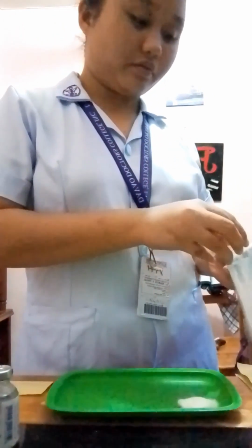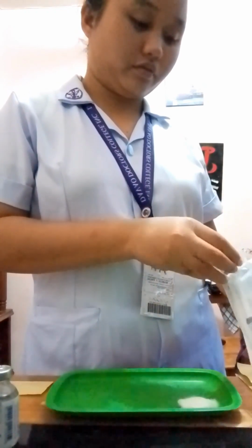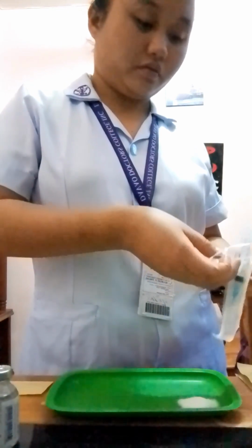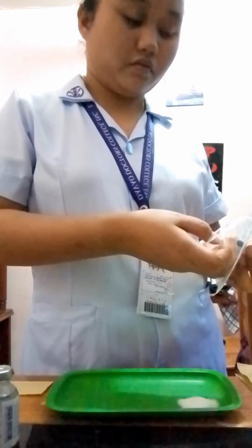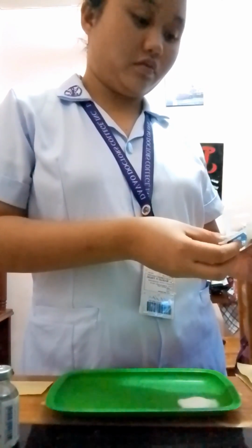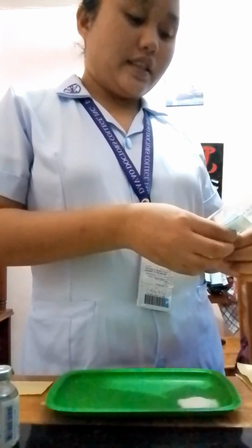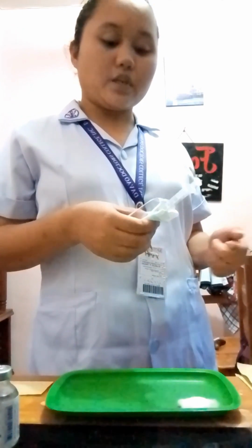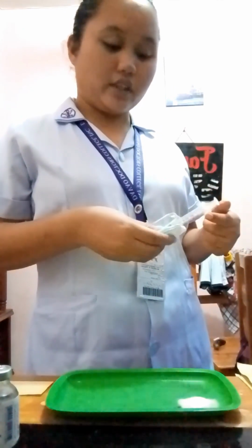Now we just need to open the sterile pack. And since my syringe is readily connected to the needle, I have to separate the two first so that I can get the aspirating needle into my syringe.